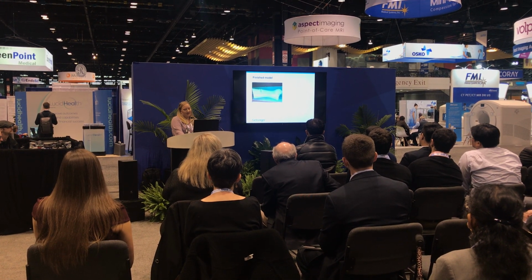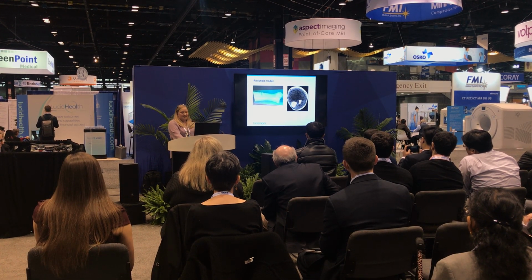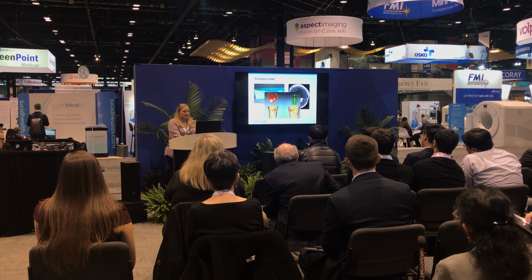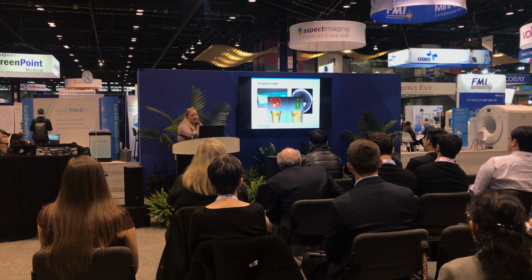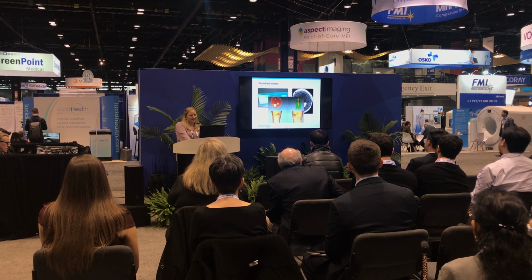Here's some images from it. So there's your scalp. That's the CT. And then, since I'm the lead tech in the 3D imaging lab as well, we put it in TeraRecon and got some 3D reconstructions. On that bottom left window, you can actually see the bone sticking through the wound. I thought that was pretty neat.